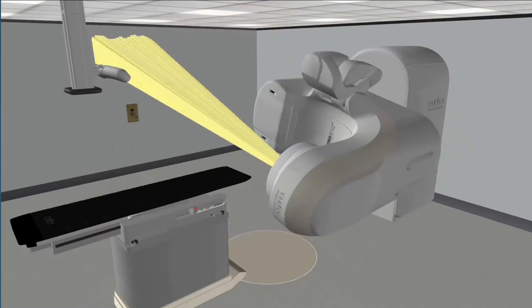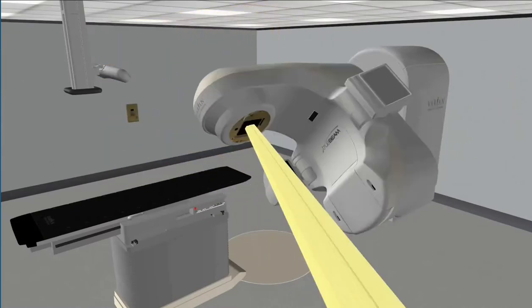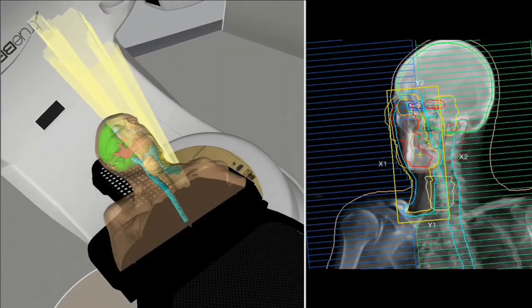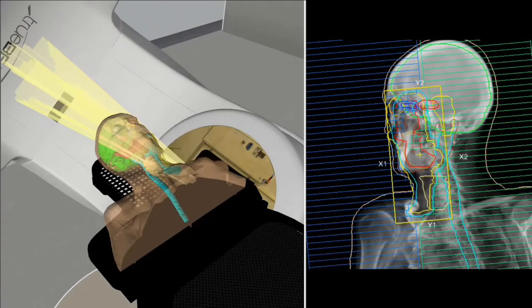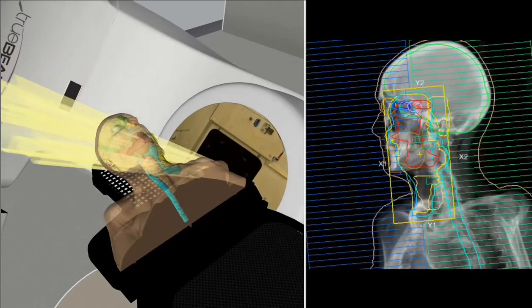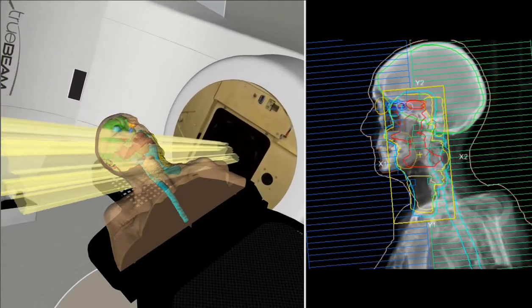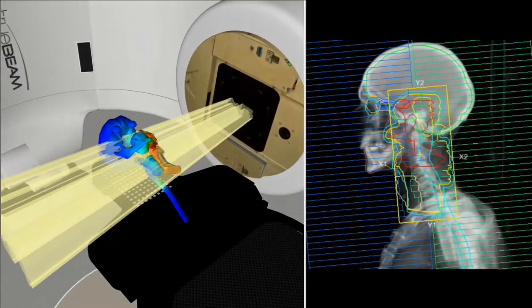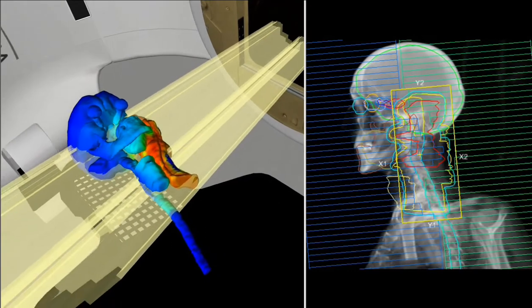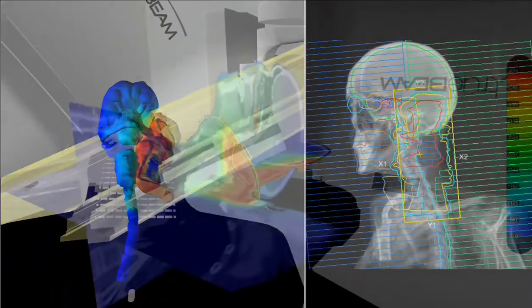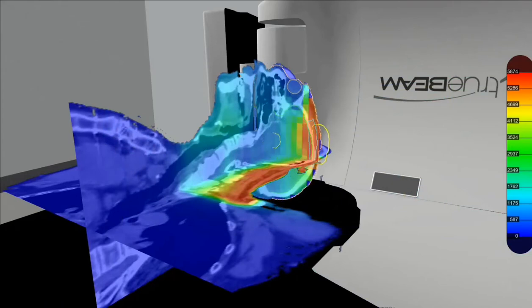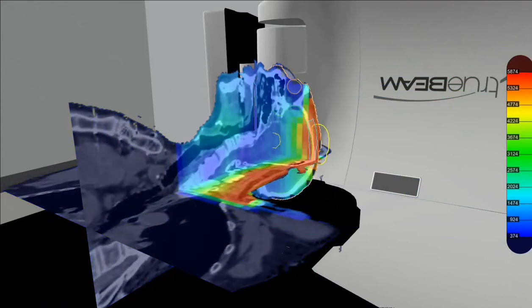VIRT can easily display the concept of beam divergence. Its animated beam delivery displays the gantry rotation, collimator movement and MLC positions, which are an accurate representation of any DICOM plan imported into the system. Plan dose can be displayed on the CT slices, allowing the audience to have an in-depth look at the dose each area receives.